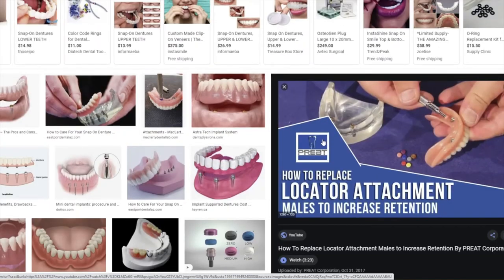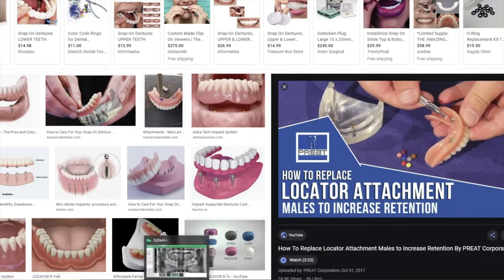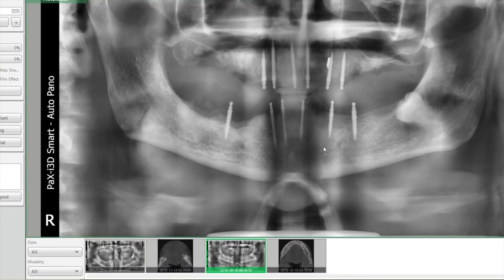One other very crucial piece of information that I wanted to show you guys is in regards to maintenance. Okay, so this is not my patient, but this patient came in for a consultation because he came in like this. He had surgery. He had some mini implants placed by his dentist, and he ended up in the emergency room 48 hours later, and he was asking me what's going on here. I was telling him, number one, these are actually not the type of permanent implants that you want to get placed in your mouth. The dentist placed these on this patient and sold him basically temporary implants, which should only be used temporarily to maintain the bone, and sold this to him as a permanent snap-on denture prosthesis.